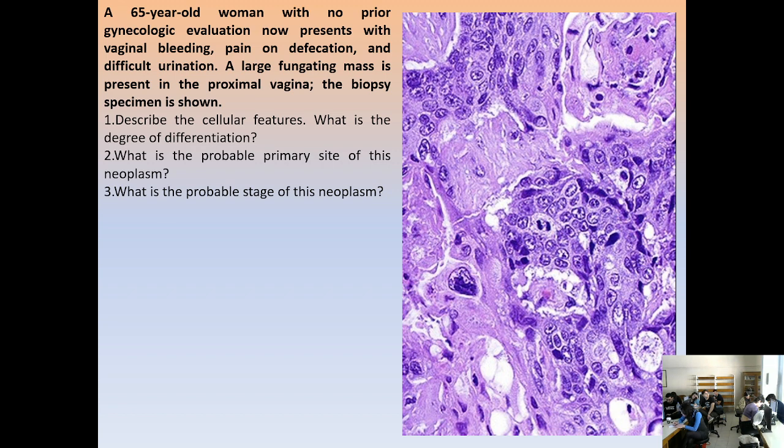That has to do with the invasiveness, how they invade. To define the nature of the cells, which markers are available and in which technique? It's not a routine stain. I think we said that in our first lesson. Yes, please? Is it Masson stain? This is for connective tissue. Masson is a histochemical stain. These are histochemical stains. The stain I am asking for is not histochemical.